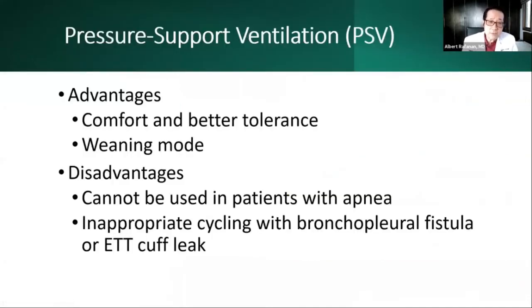The advantages of this: it allows comfort and better tolerance. It is a weaning mode. It allows us to decrease the amount of pressure support as the patient's breathing improves. The disadvantages: it cannot be used in patients with apnea, but most of the ventilators right now have an apnea backup. So in patients who are put on pressure support, if they go into apnea, then the machine will kick in and put them on SIMV or AC depending on the default setting you put.